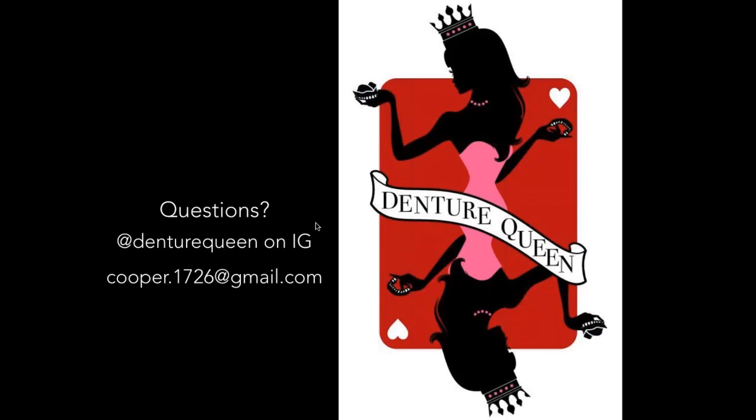What is the best way to start incorporating digital dentures into my practice? I think the simplest way for most doctors, if you do not have an intraoral scanner, is to go with the conventional workflow that I referenced earlier, where you make preliminary impressions and have custom trays and wax rims fabricated. When you get those products, you will make your impressions with the custom trays, and you will also put a light amount of wash material in the wax rim, and then start making your marks and records with your wax rim.